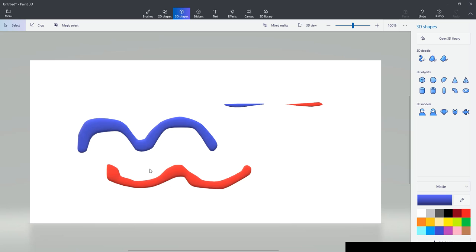In paradoxical septal motion, we see an opposite motion between the septum and the free wall. When the septum contracts, the lateral wall relaxes, and when the lateral wall contracts, the septum relaxes. We call this paradoxical septal motion. In ASD we have paradoxical septal motion.